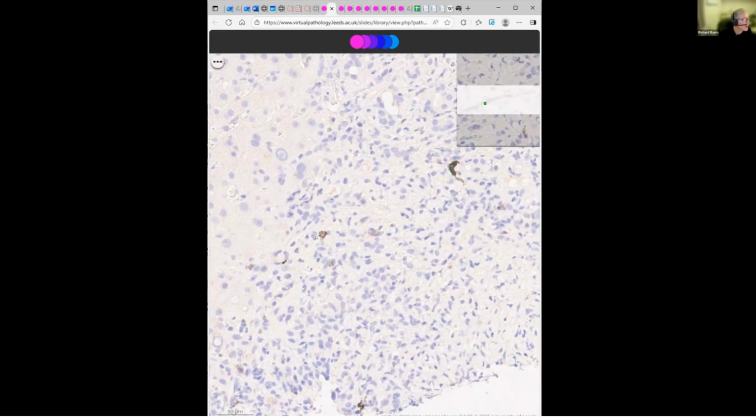Right. So Venkatesh asks, how to differentiate Hodgkin and peripheral T-cell lymphoma with RS-like cells. Again, I would say that's going to be on the basis of immunos. I don't think you can do it reliably on H&E alone, because T-cell lymphoma can also have infiltrating inflammatory cells, just like Hodgkin.